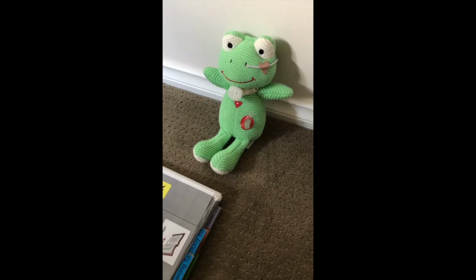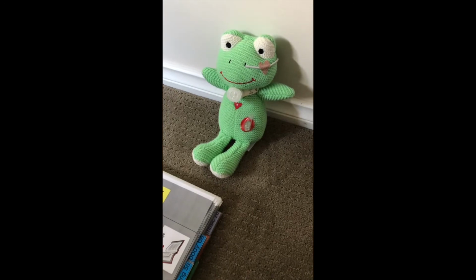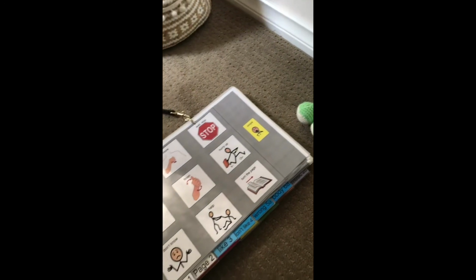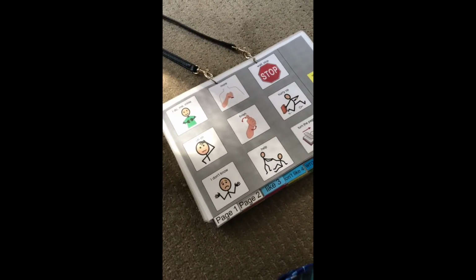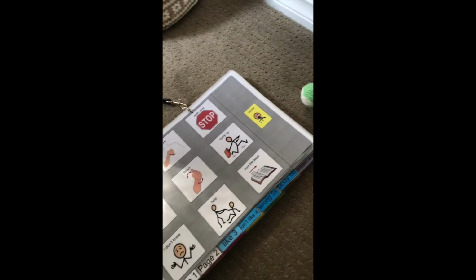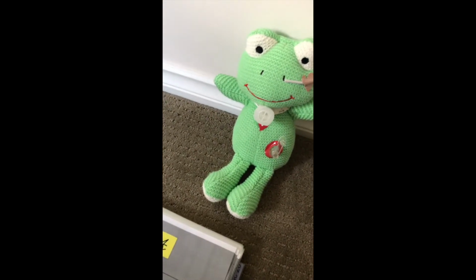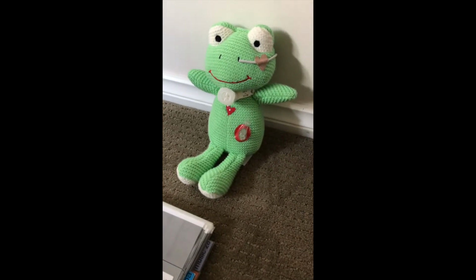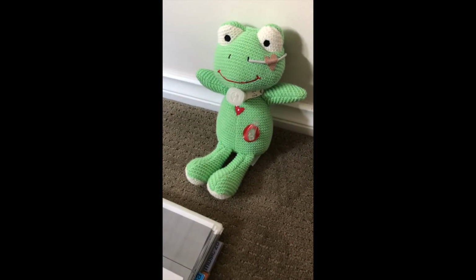Partner-assisted auditory and visual scanning is going to look a little bit different when you are using an AAC book. So here I have my communicator, my little froggy friend, and I've got a pod book. Whenever you're doing partner-assisted auditory and visual scanning with an AAC book, what you need to think about is, how is your communicator going to indicate yes and no? Because now they don't have a switch to make a selection.